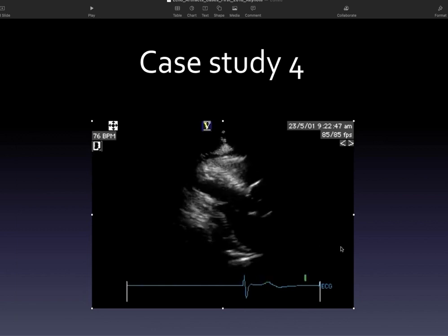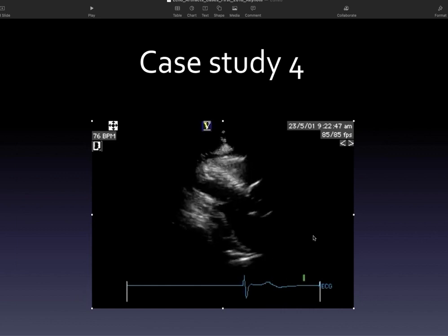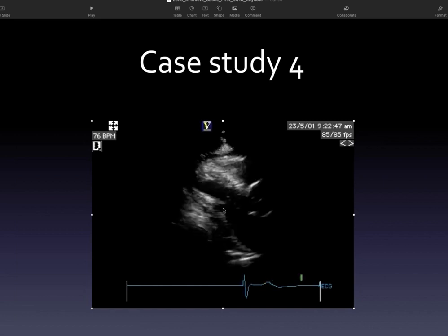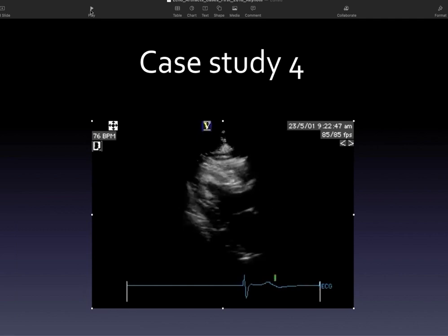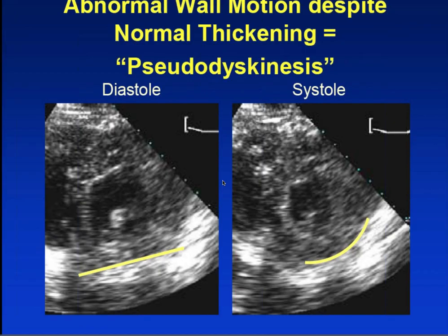Yeah, I know it's very choppy. I really apologize. Are you talking about the posterior wall close to the left atrium? Yeah, like this part. Look, we can see almost the appearance of a double wall. Again, the image is not that clear, but I'm wondering if that's what you're talking about. If so, it's possibly related to a refraction kind of artifact, where you would see almost a double structure there at the end.